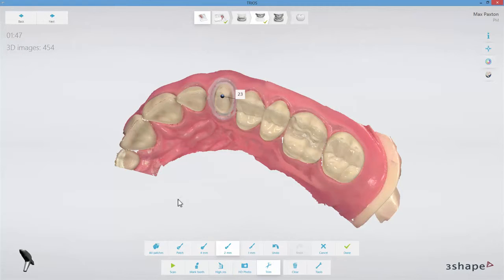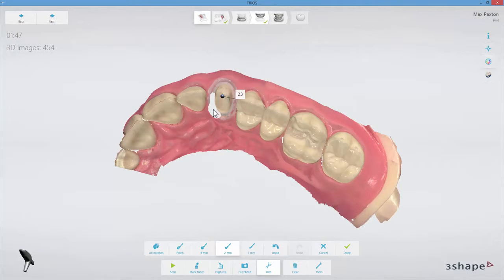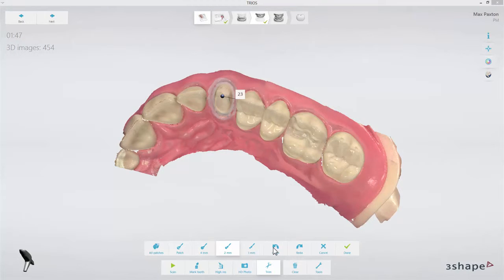You can also use Trim to edit your preparation. In case you wish to slightly change the margin or the height of the preparation, just trim it away. If you trim a locked area, the area is no longer locked and you will need re-scanning.